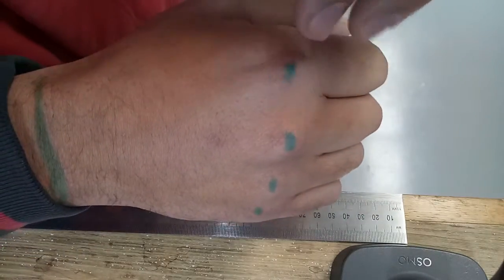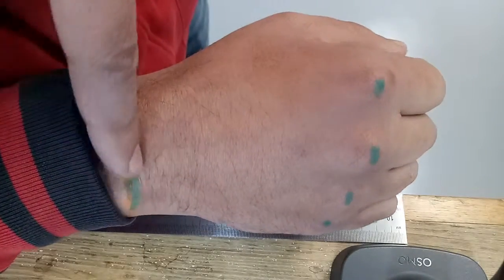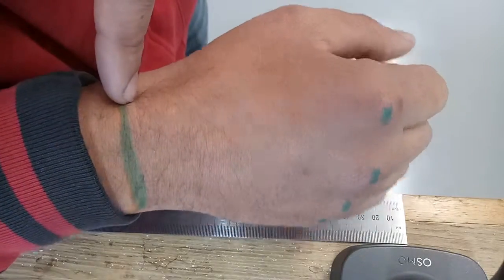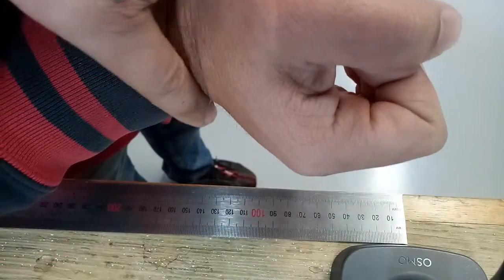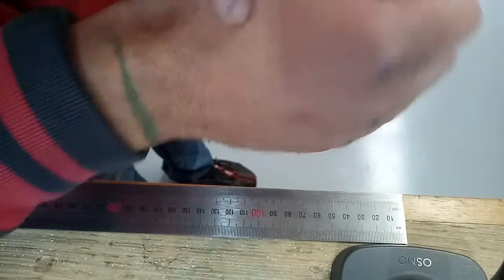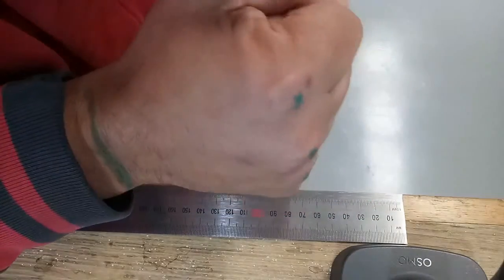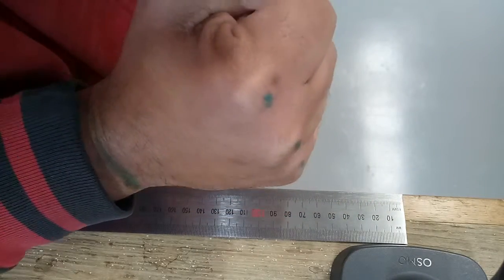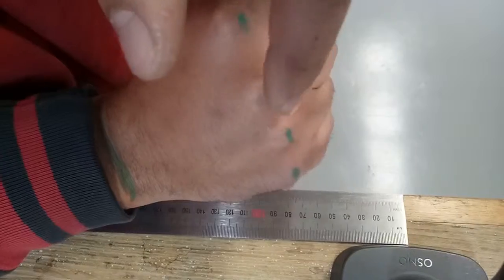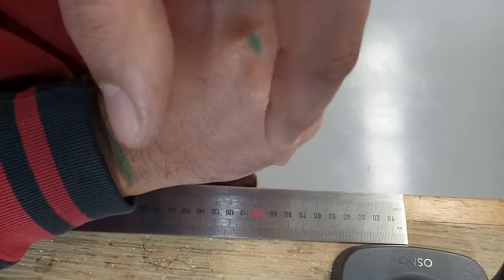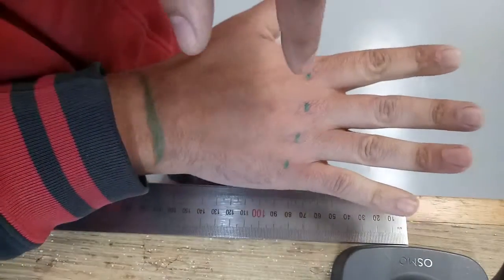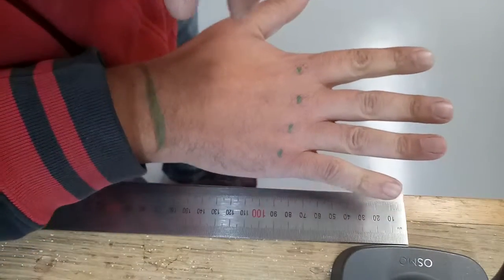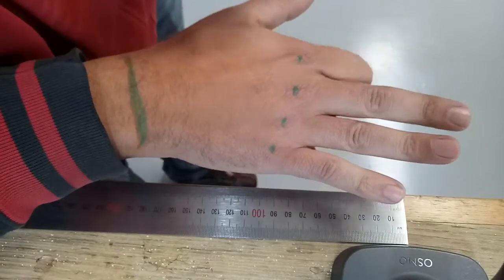So the first step is to draw a line across the wrist position here where it creases, as well as with a closed fist a dot on each of the knuckles so that we can tell from the photographs where those knuckle positions are.